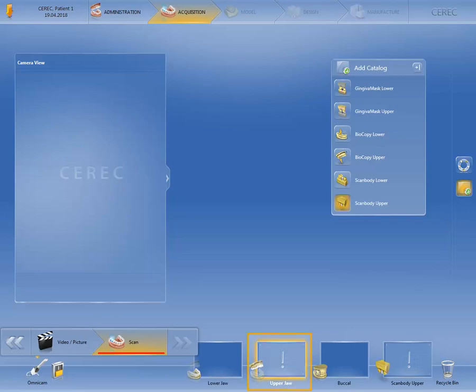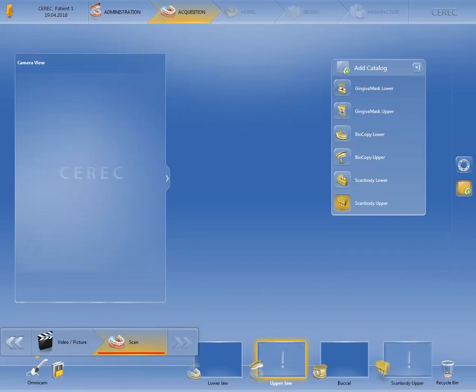The upper jaw image catalog, which is framed in yellow and therefore active, is, along with the scan body upper image catalog, marked with an exclamation point. This means that both image catalogs are an obligatory acquisition. In addition to this, you'll find the lower jaw and buccal bite image catalogs.